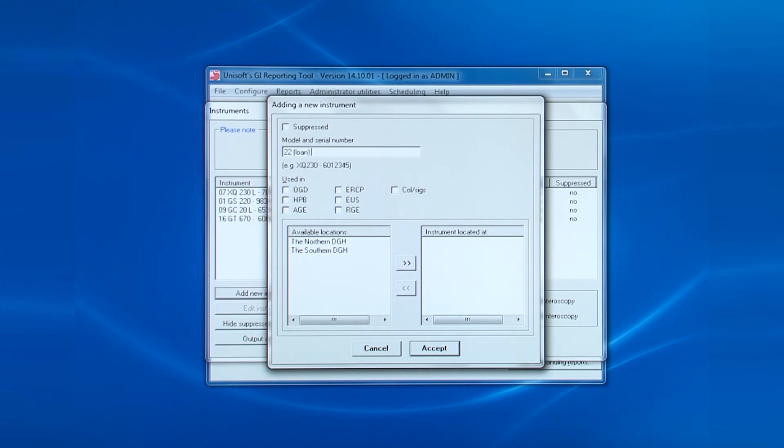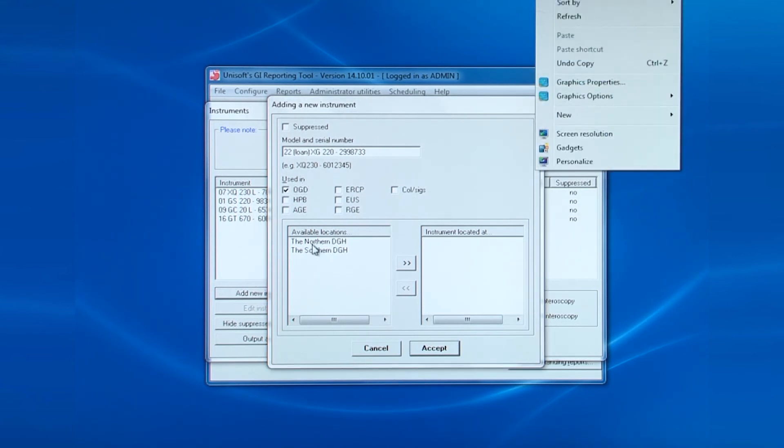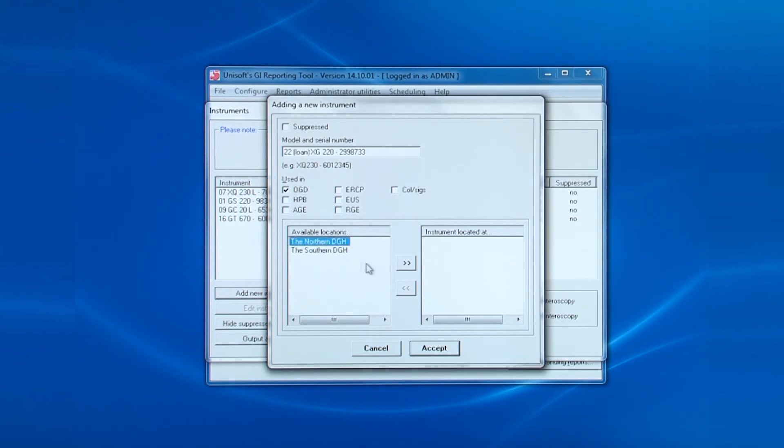Here, the word loan is being added in brackets after the unique identifier. Also shown is this is for OGDs and is only available at this one hospital. Then click accept.